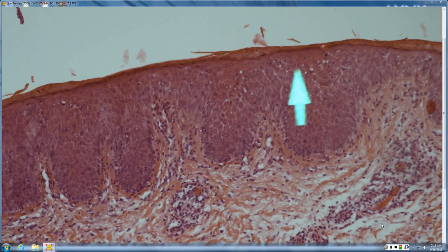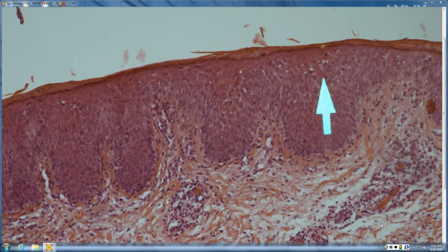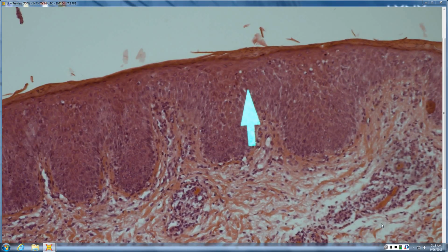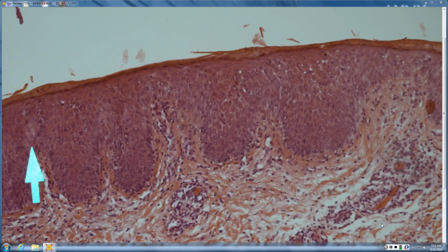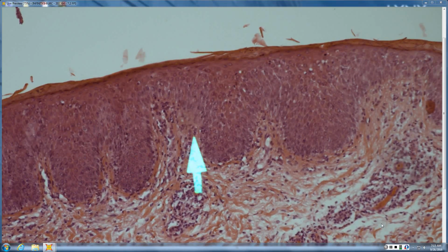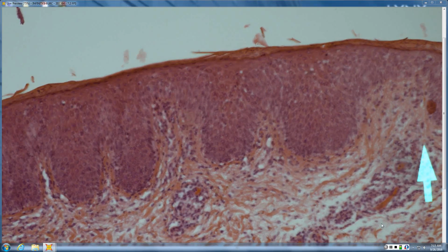Plus, you get quite a bit of spongiosis here in the actual epidermis. So spongiosis, generally speaking, goes against psoriasis, except for those few types. And you do have some lymphocytes in here, but not a whole lot. They're more just coming up from exocytosis, and they're not necessarily tagging the DEJ. It's not producing a vacuolar interface pattern, so it's not going to be MF.